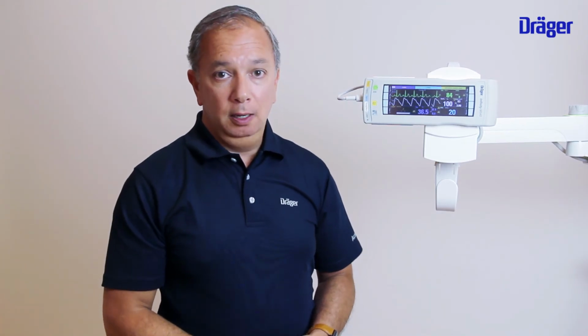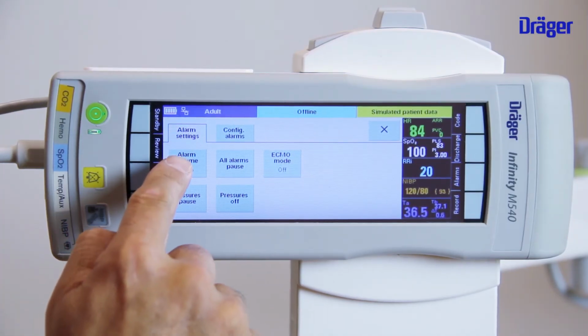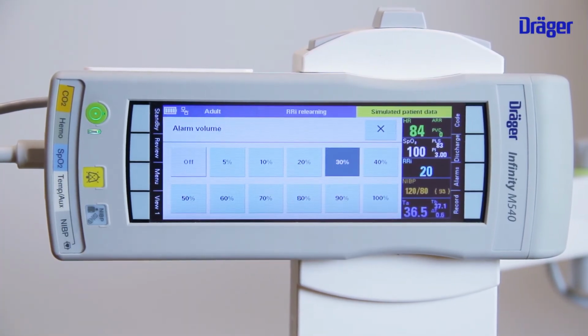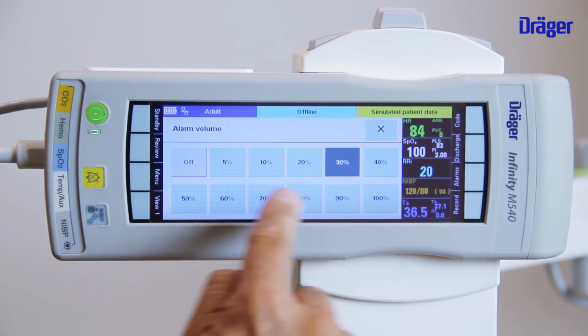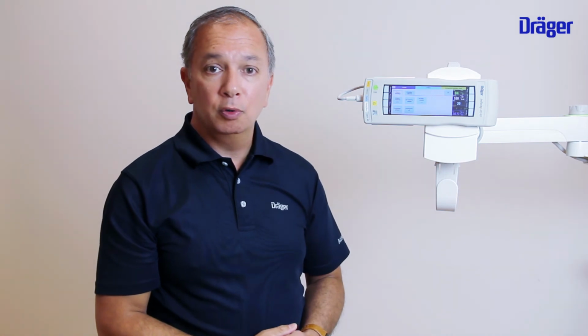When you push the key alarms over here, you have 2 tabs. The first tab is alarm settings, where you can change, for example, your alarm volume. It's over here. The second tab is your alarm configuration.